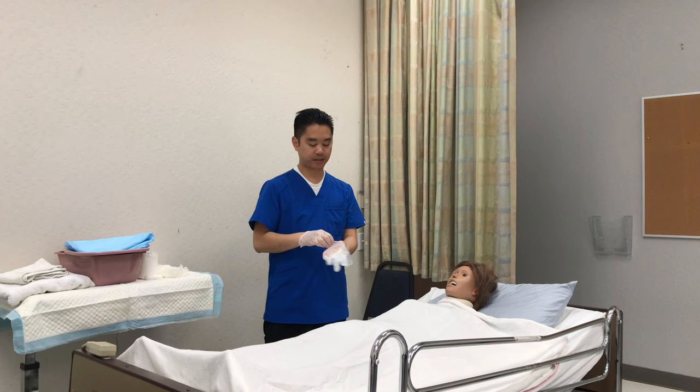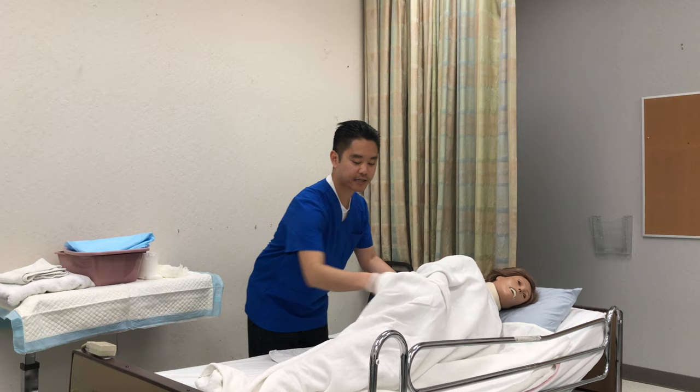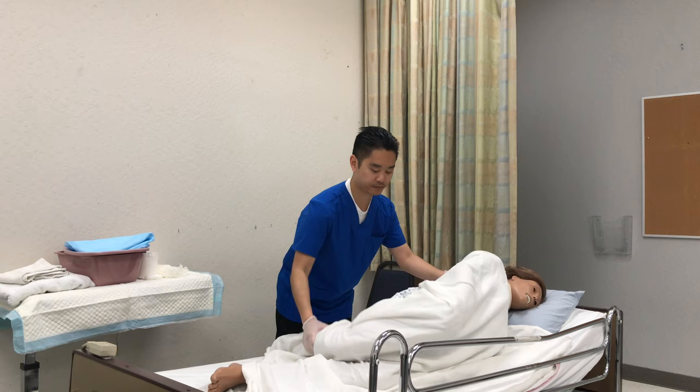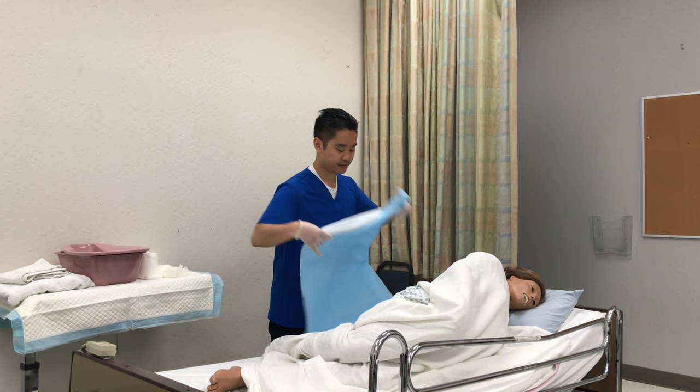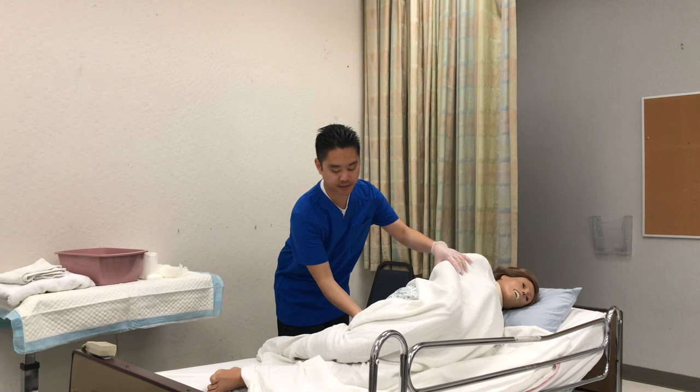Mrs. Smith, I'm gonna ask you to turn to the side — please cross your arms and cross your right leg over your left leg. On the count of three we're gonna turn: one, two, three. I'm gonna ask them to hold on to the side rail. I'll place a chucks alongside their back, and then with the bedpan I'm gonna put some powder on the rim so they don't stick to the bedpan. I'm gonna place the bedpan against the patient.